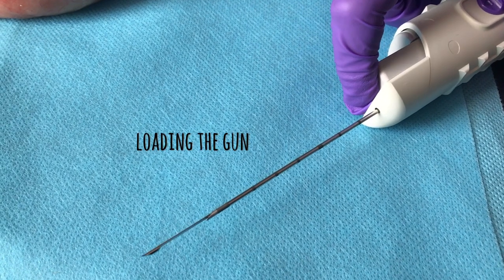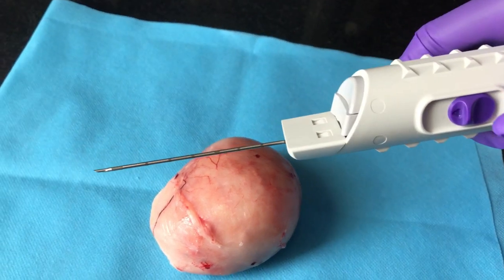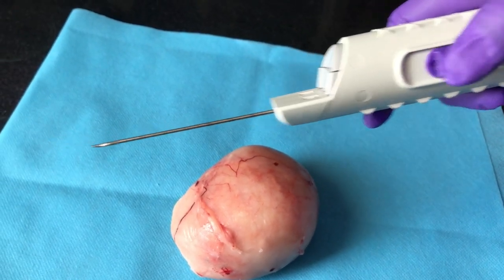Now I am loading the gun to take a biopsy sample. The gun is ready to take a biopsy from the tumour. Let's see what happens now.